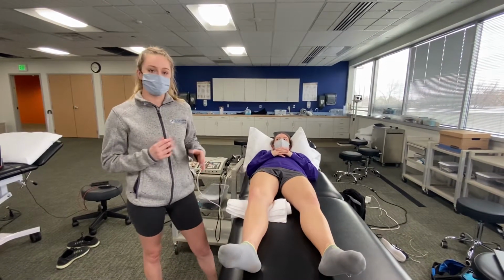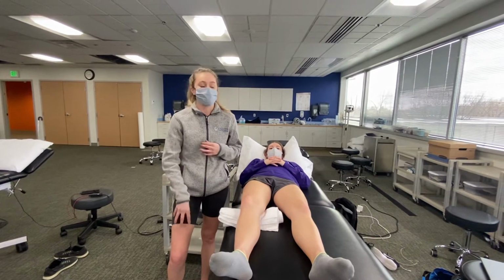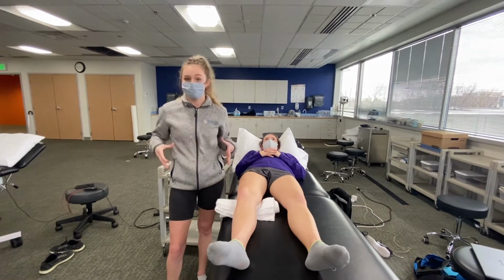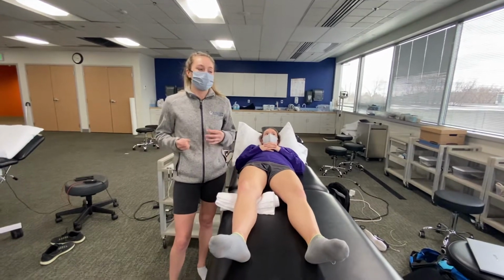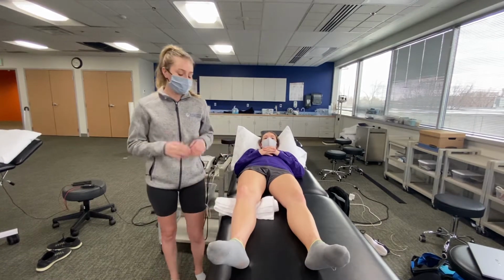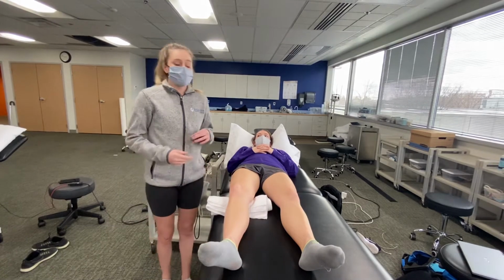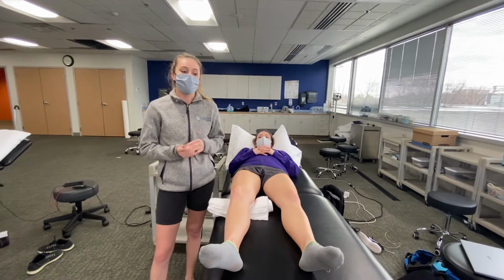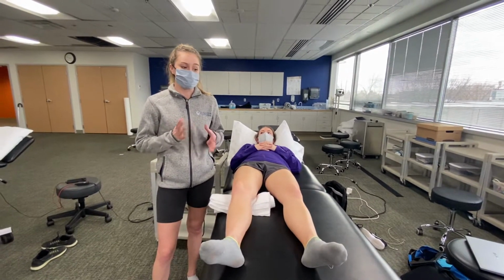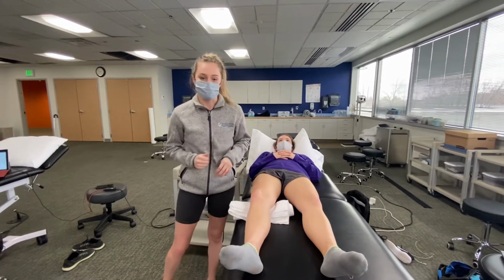Some contraindications: we don't want to place the pads near the eyes or near the carotid sinus. If there's a wound, avoid that. If the patient has a pacemaker, we avoid that area. If the patient is pregnant, we avoid that local area. We also want to make sure that the patient is cognitive and aware, and that they have sensation of the area we're applying the E-stim to. We already did a dermatome test, so we know she has sensation of her knee where we're applying it. And we also know she isn't at risk of thrombosis, which is another contraindication.